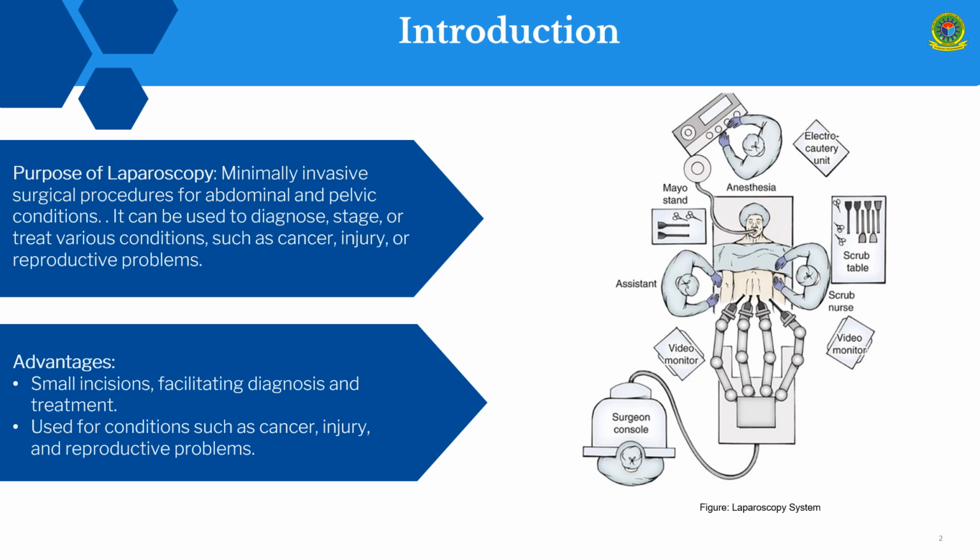What are the advantages? We make a small incision that facilitates diagnosis and treatment. Also, it is used for conditions such as cancer, injury, and reproductive problems that we have already mentioned earlier. The right side image illustrates the whole laparoscopy system.